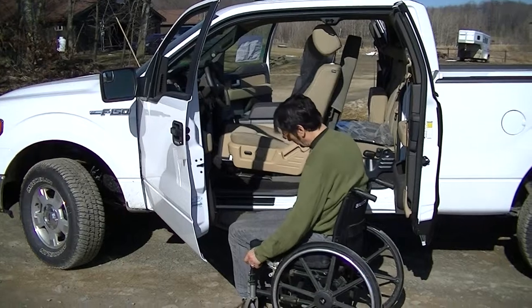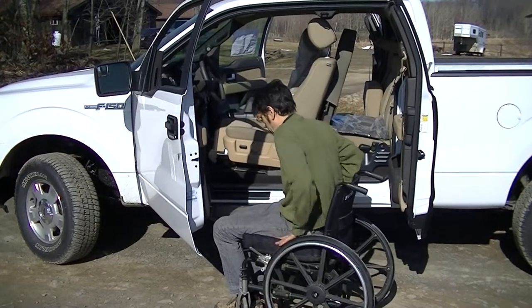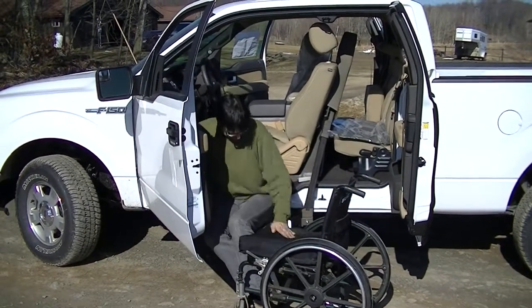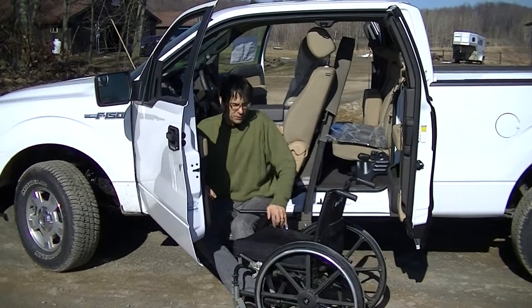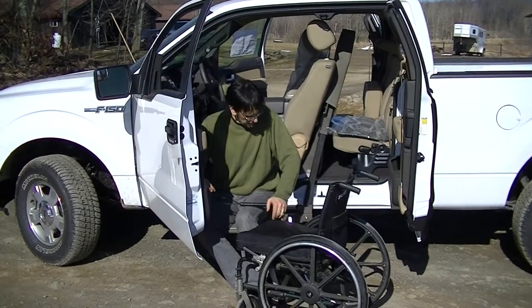We pull up and lock the wheelchair. Once we get in position, we can stabilize with the handy safety handle here.